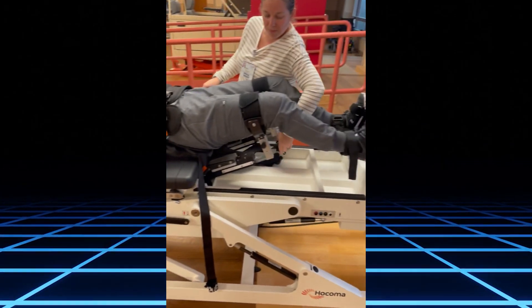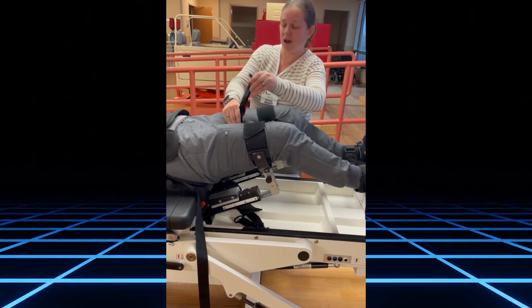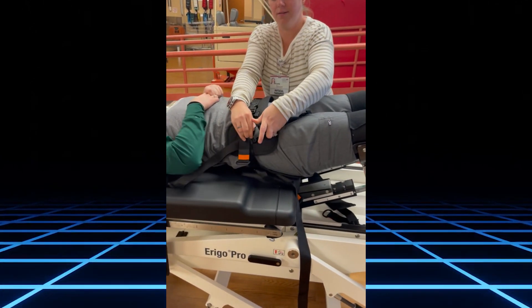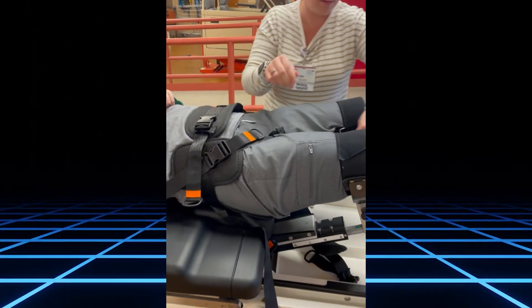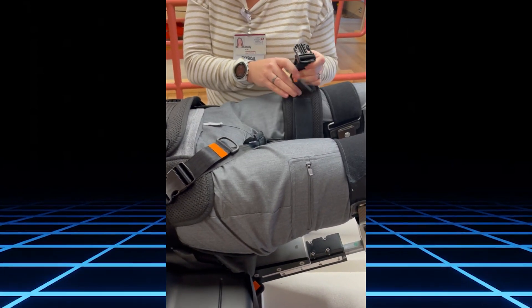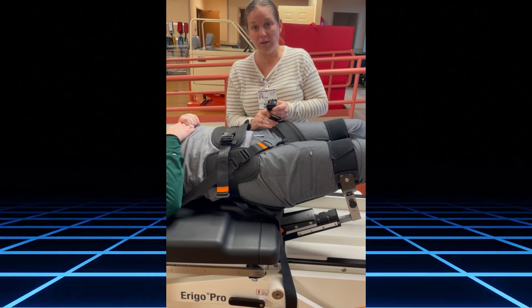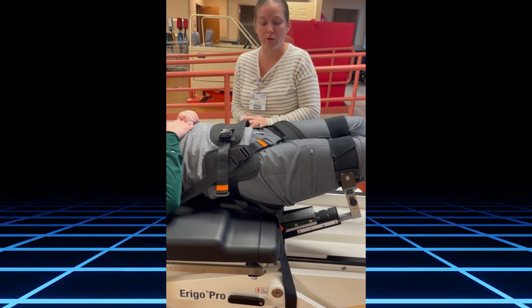Then we have two groin straps. Here is the right groin strap — it connects here and you pull it snug. For men, we tend to pull it out laterally first and then attach it for improved comfort.